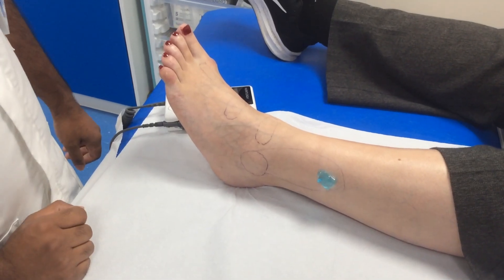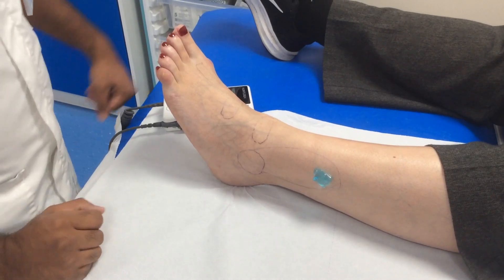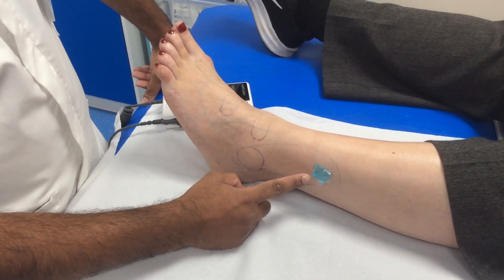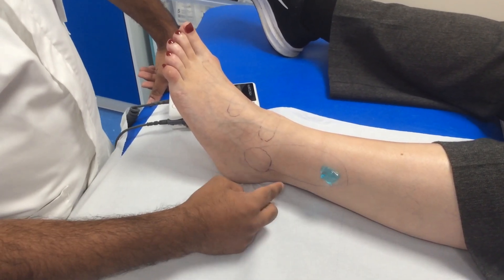Today I'm going to demonstrate how to check for the peroneal pulse using a Doppler. Begin by applying some ultrasound gel to the outside of the patient's leg, just above the lateral malleolus. I'll be searching for a pulse in this area here.